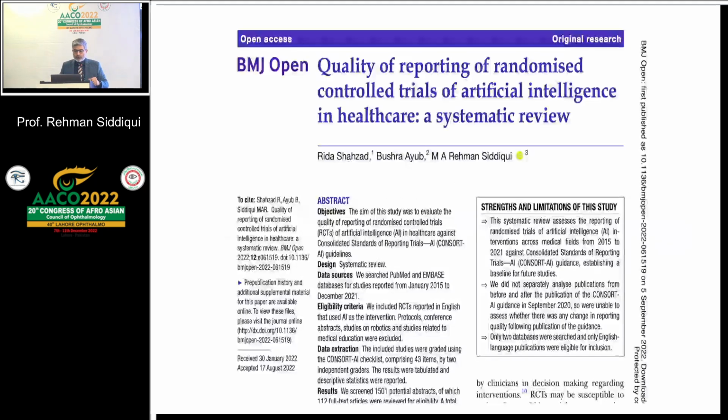The model is moving around and training on the patient's images rather than the data set, and that provides reassurance to the organizations and to the patient that their data is not being misused or used without their permission. So this is a new concept that is taking place.